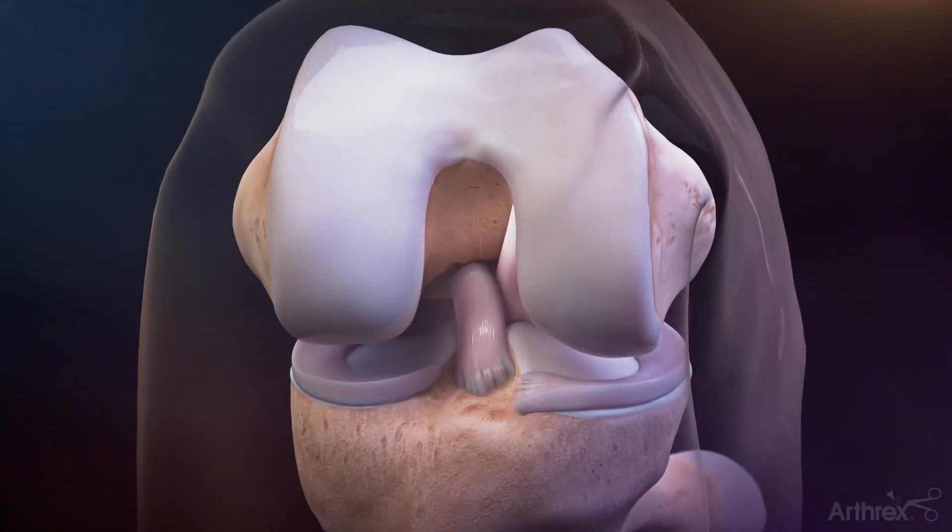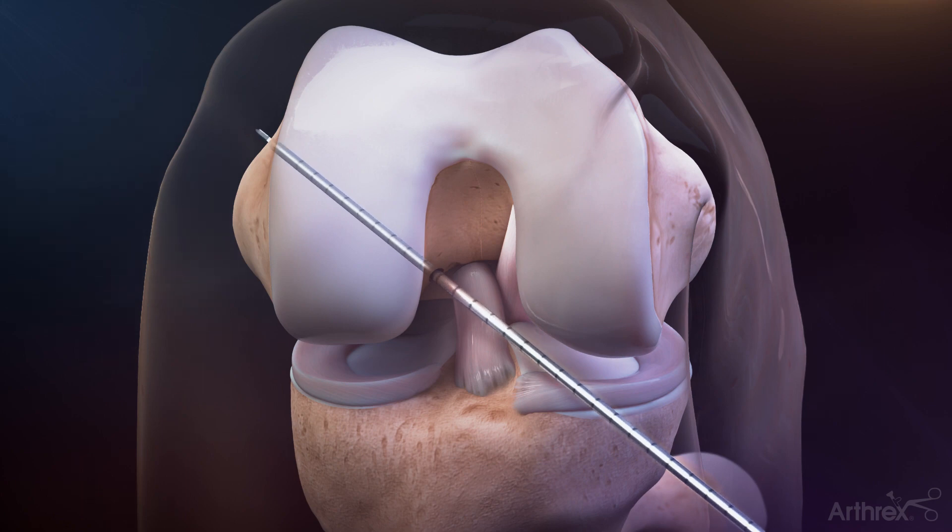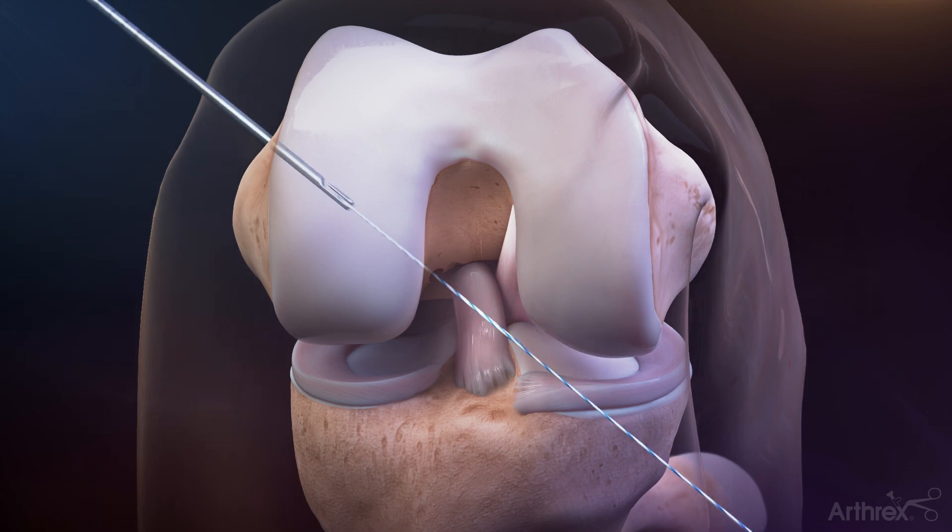Using a tightrope drill pin, drill a tunnel at the center of the femoral ACL footprint. Using the eyelet of the ACL tightrope drill pin, pass a fiberlink suture tape and snap for later use.